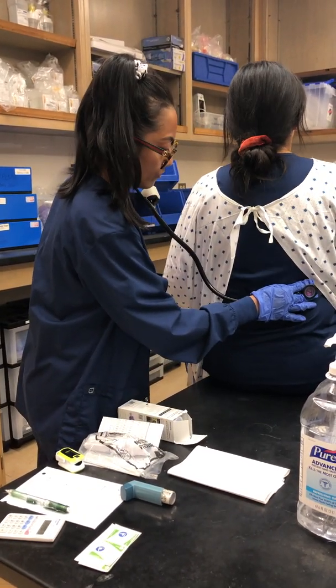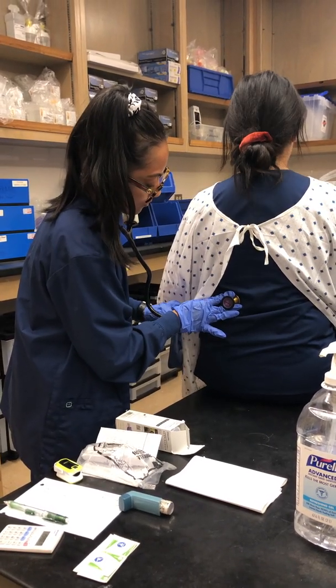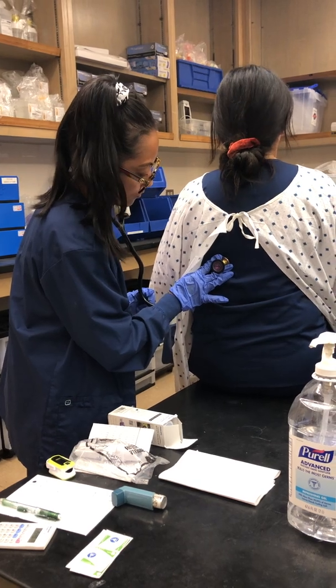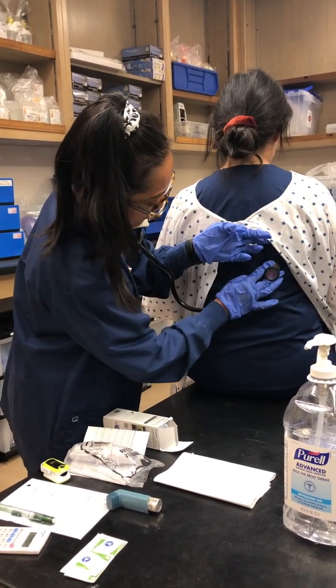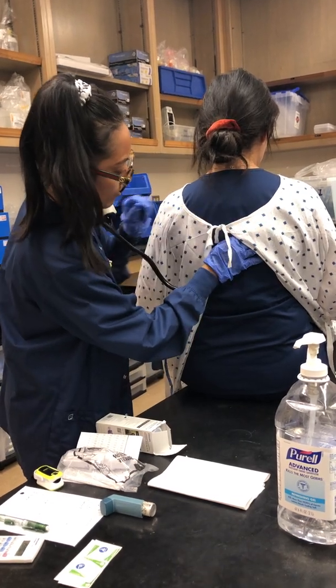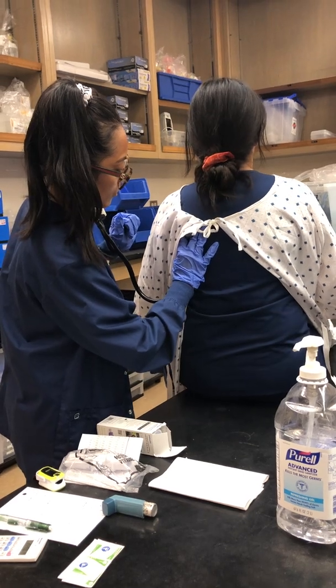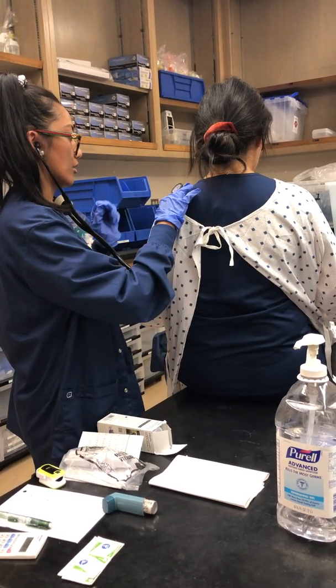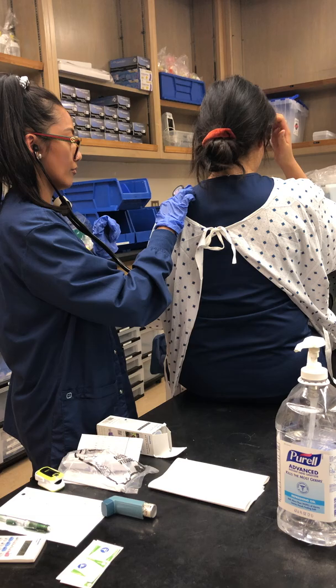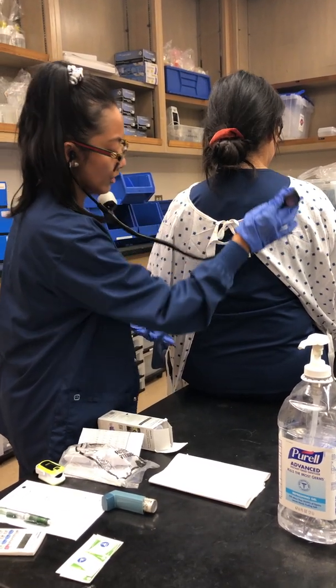Go ahead. Okay. I'm going to do the sides.